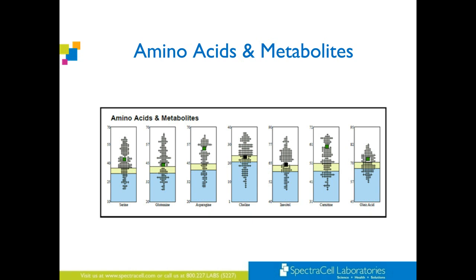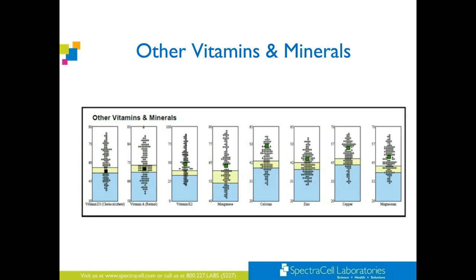This, of course, is a lower portion of the first page of the testing, and you can see here where vitamin A is borderline and vitamin D is borderline. Once again, I'm going to correlate how some of the things on the CBC and CMP may correlate with these two nutrients. Or if you did this test first, you would see that it's an early sign of something going on biochemically, and yet it may not have displayed itself yet in the CBC.